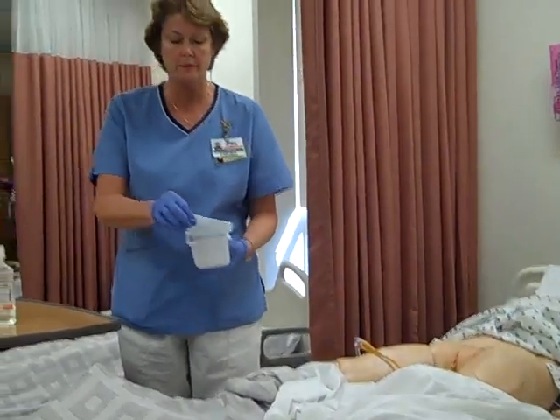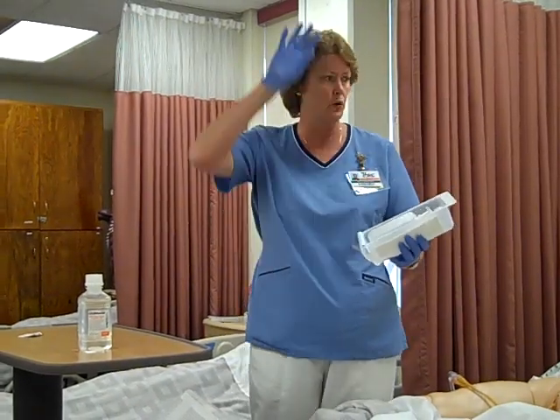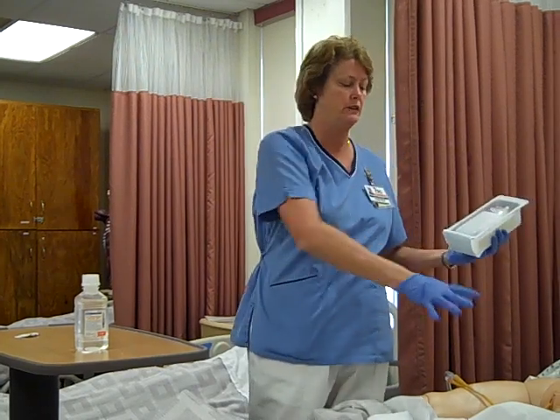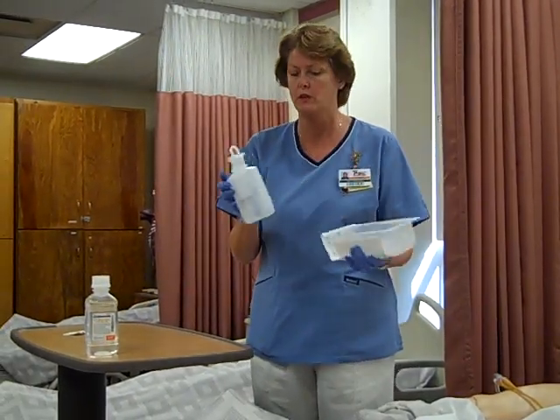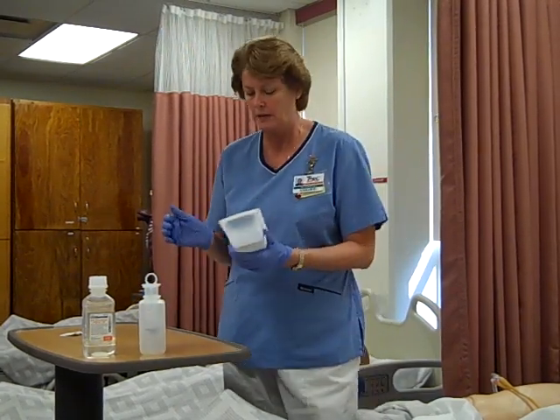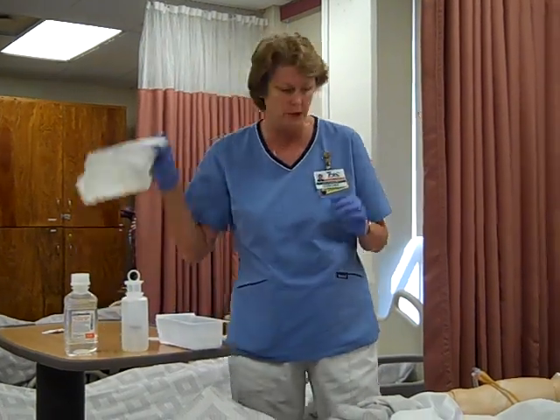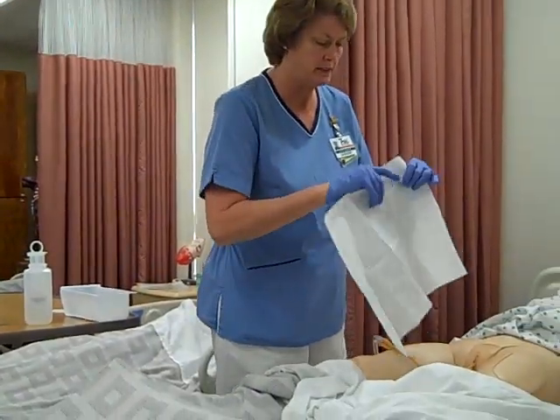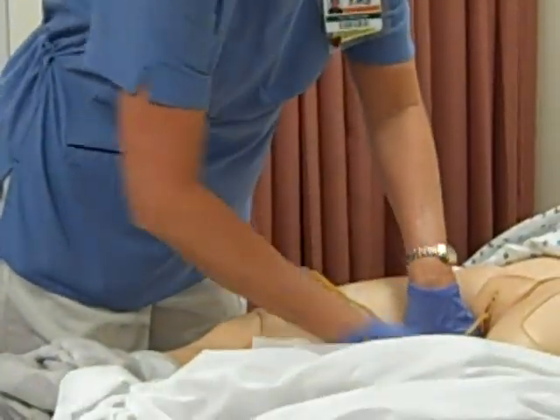We'll open our tray — you want to try and keep the inside of this sterile. Of course, we need to provide our privacy, so we wouldn't have the patient exposed like this and we would have our curtain closed. Pop out your irrigation syringe. Inside should also be an alcohol swab and a little white chucks pad. We're going to put the chucks pad underneath the patient, shiny side down. This doesn't need to be sterile; it's just to protect the bed.